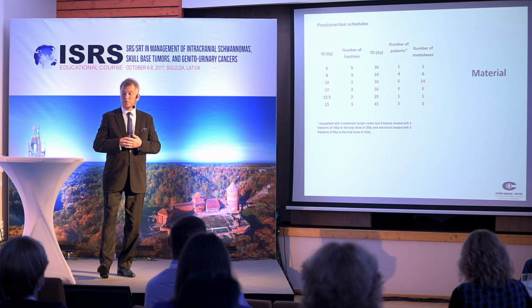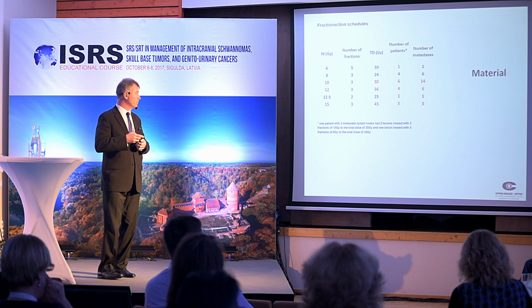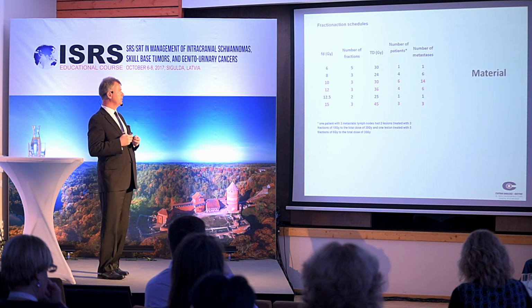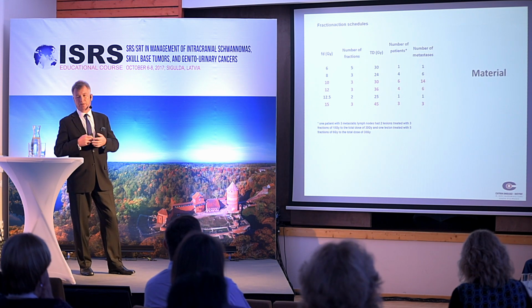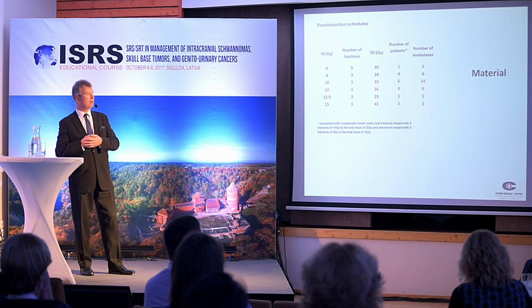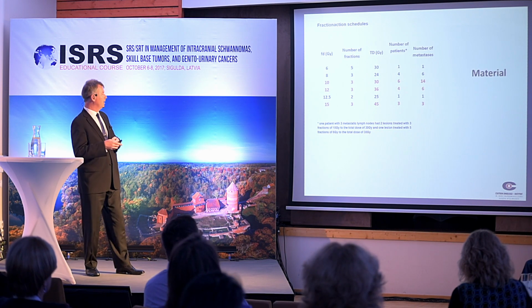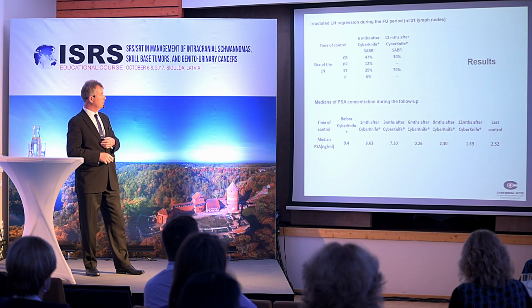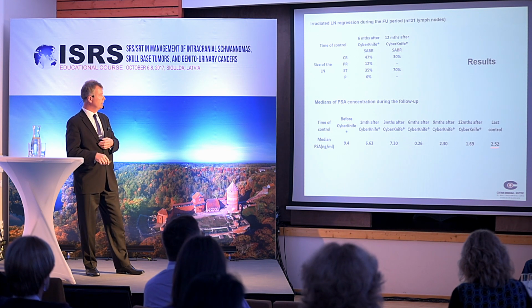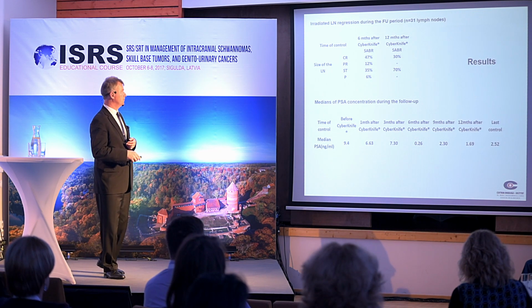We did it using fiducial tracking and usually Synchrony, as well as spine tracking. So what did we do? We used different schemes of fractionation, and now I think only those marked in red could be considered radical ones. What did we find? Excellent local control. You see after 1 year it is 100%, and a quite large and fast decline of PSA concentration.